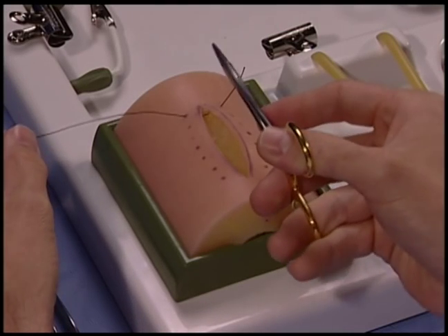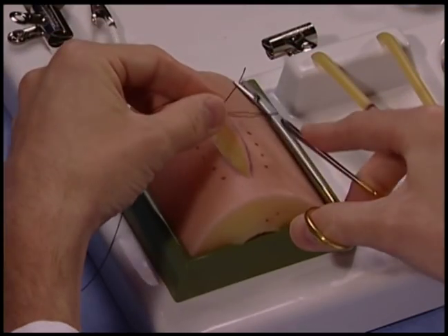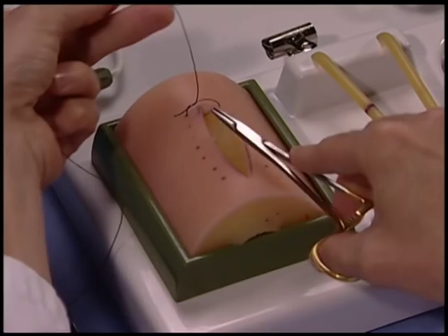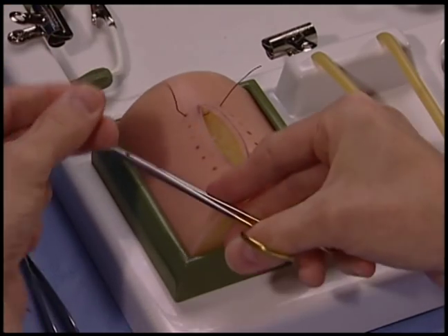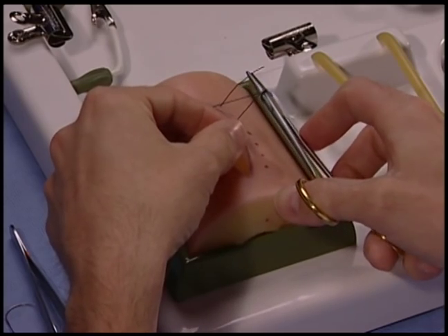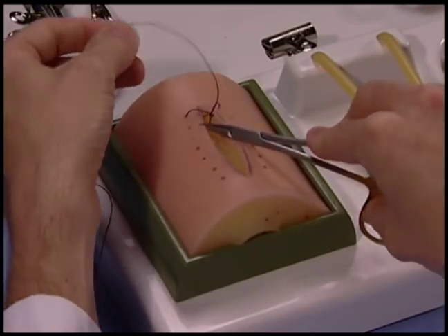The needle driver should be held parallel to the wound on the inside of the suture. This allows for your throws to be square. The needle driver is brought to the outside of the suture, as shown here, it throws an extra loop in the suture and prevents the knot from being thrown down squarely.